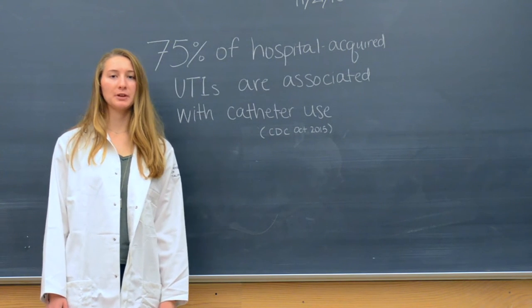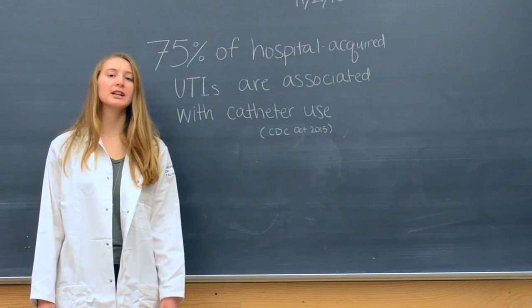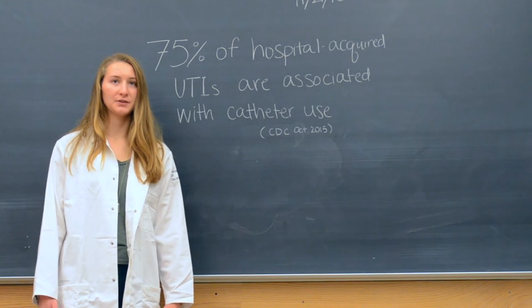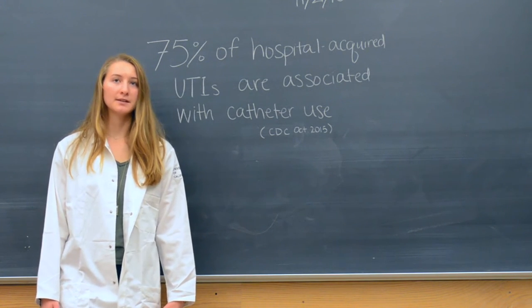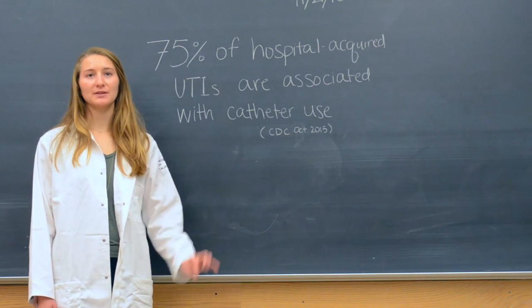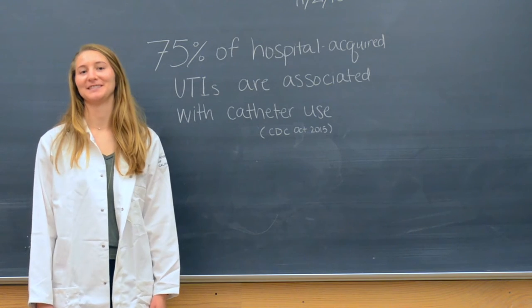The problem our group would like to address is that the majority of hospital-acquired urinary tract infections are caused by catheter use. We believe that we can mitigate this by implementing the anti-fouling surface onto the catheter in order to reduce these hospital-acquired infections.